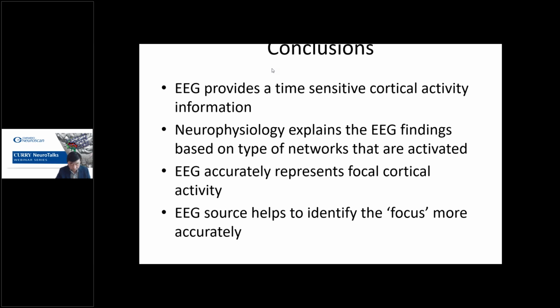But the problem with this is that it requires very high-end EEG analysis. The major problem with the scalp EEG always has been the contamination. So you get muscle activity, you get movement artifacts, and that makes this analysis hard to do. But every day we're improving, and perhaps we can eventually use EEG as a tool to help those patients.